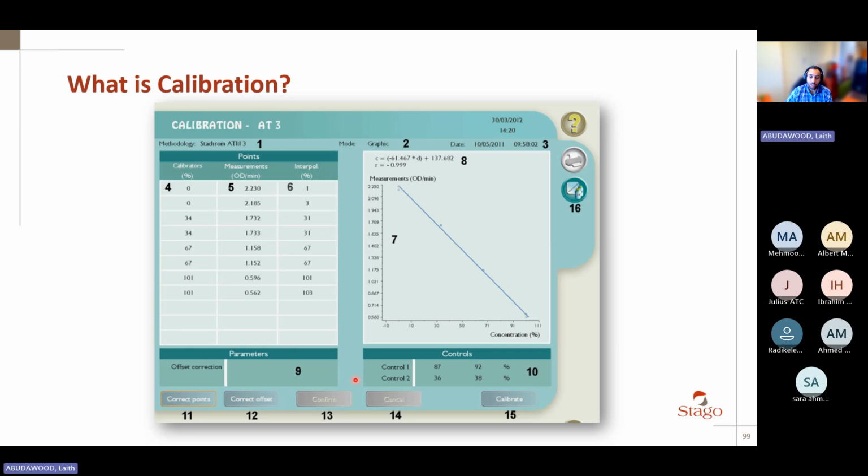Another point that may be very useful, QC is failing, calibration looks absolutely perfect. You can compare this calibration with the previous calibration, because sometimes you may have cases, maybe the user, for example, prepared the calibrator with 2 ml instead of 1 ml. Everything will be half the value, but the interpolation, everything will be half the value, but the R value will look perfect. So you think everything is passed if you do not look carefully enough. But the QC, everything will read at half the value. Okay, so if the R value passes perfectly and the QC failed, check the preparation of your reagents.